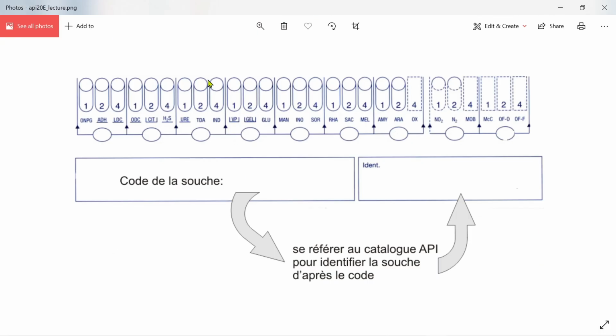So this shows the API form. So you have about 20 tests here. Okay. The oxidase test is usually done externally. Okay. So from here to here, these are additional tests. So usually, if you have enough tests until here, it is adequate for presumptive identification.